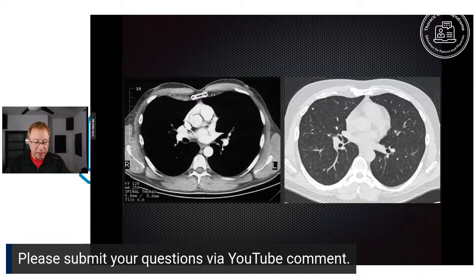You'll also see around the margin of the chest, around the margin of the lungs actually, at the edges of the black, you'll see those very, very white, bright bones. Those are the ribs. Now the image on the right is where we've manipulated the windows a little bit, and we can see the detail in the lung. You'll notice that it's much harder to see the bones separated from the soft tissues, or to see the contrast in the heart and blood vessels. So it's really the same image, but you're just changing how the computer presents it on your screen.